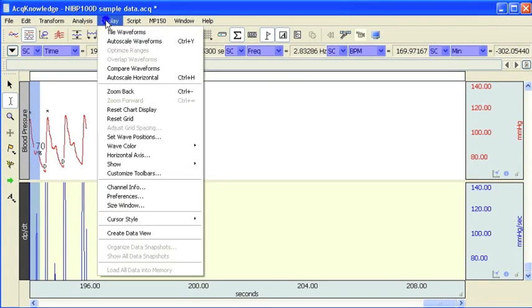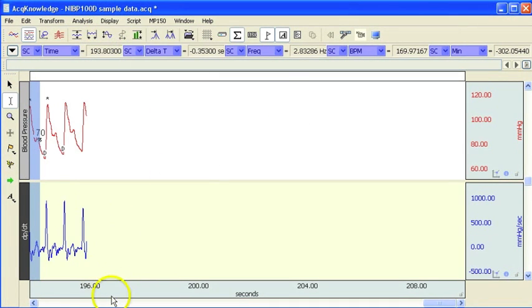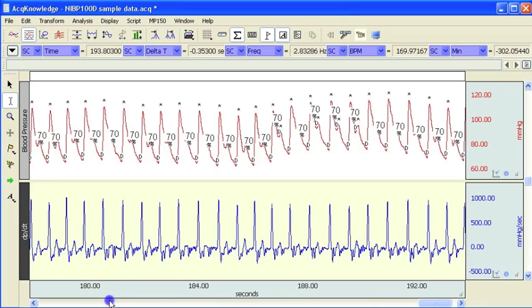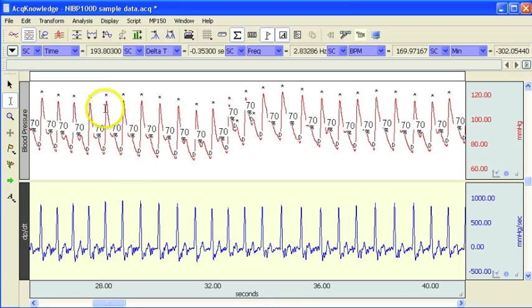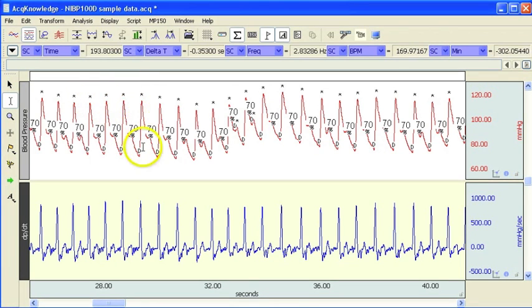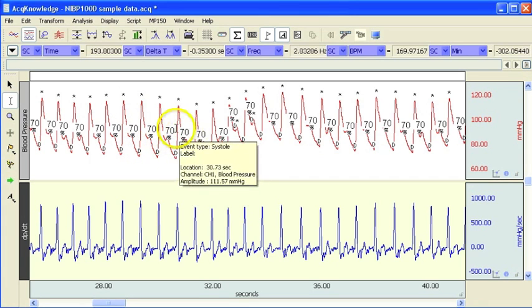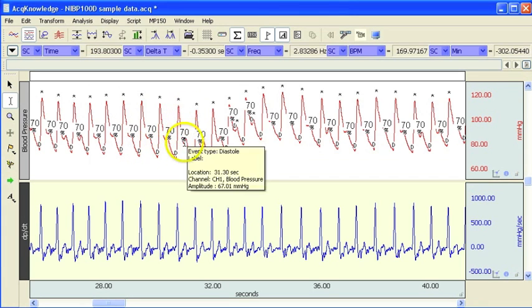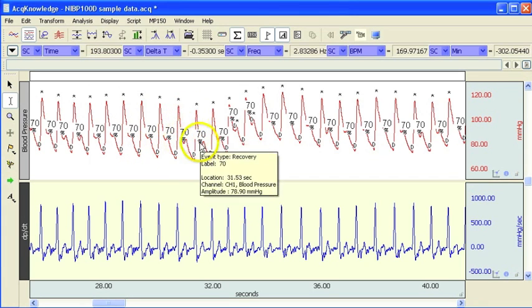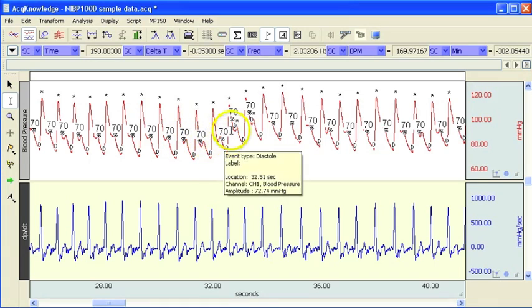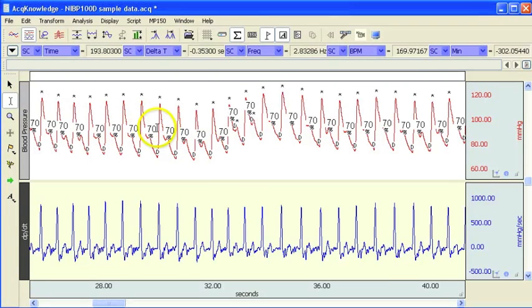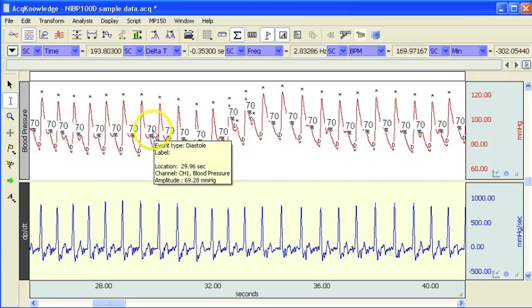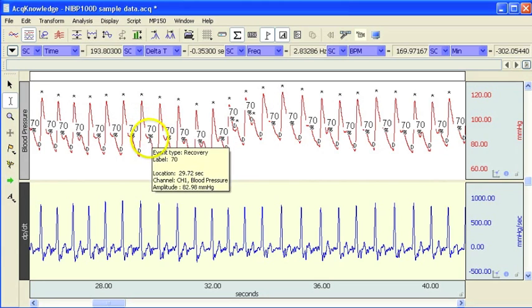If I auto scale and then come back through, we can see up above on the arterial waveform, the software has marked the systolic point with the asterisk and the diastolic with a D. And then we put in a 70% recovery that has also been marked on the waveform. And obviously if you want to mark different recovery points, you can do that by just changing the value from 70 to whatever number you're interested in.